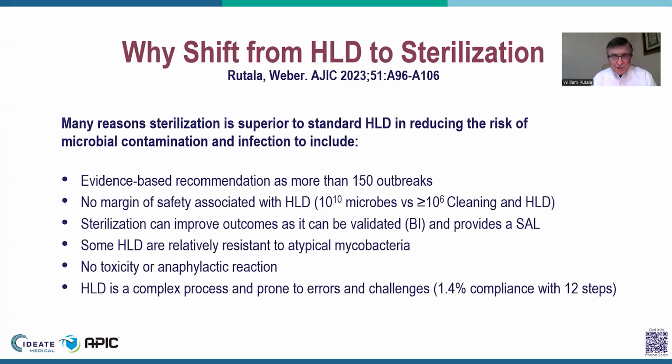One of the most significant studies I think I've seen is about 10 years ago, when they had certified endoscope reprocessing technicians perform 12 essential steps associated with endoscope reprocessing. And persons were watching their completion of those 12 essential steps.